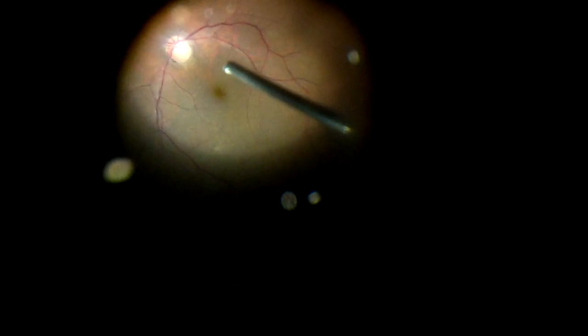And this doesn't take very long if you're set up to do this, and this allows me to remove all the debris and floaters that will give the patient clearer vision, and I don't have to worry about any inflammatory debris that I might have missed that could have fallen back. This is edited a little bit, but we do a fairly peripheral cleanup as well.